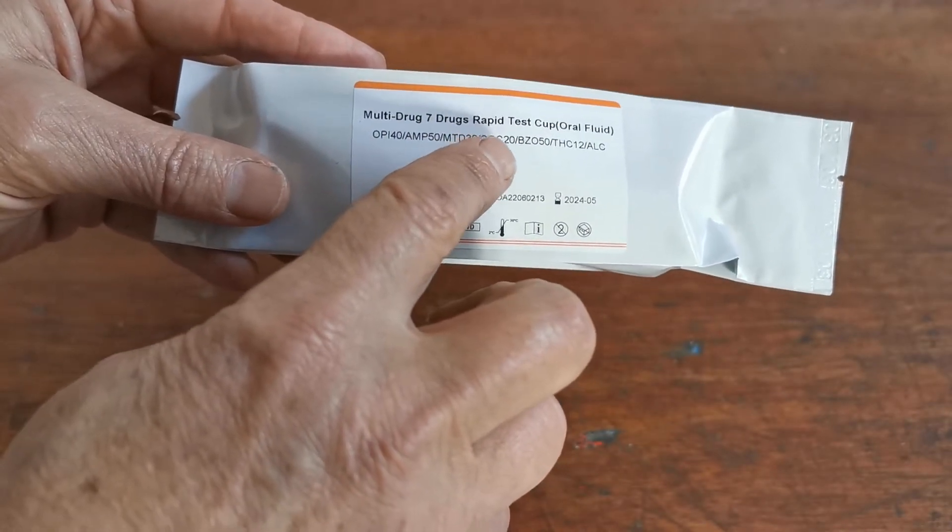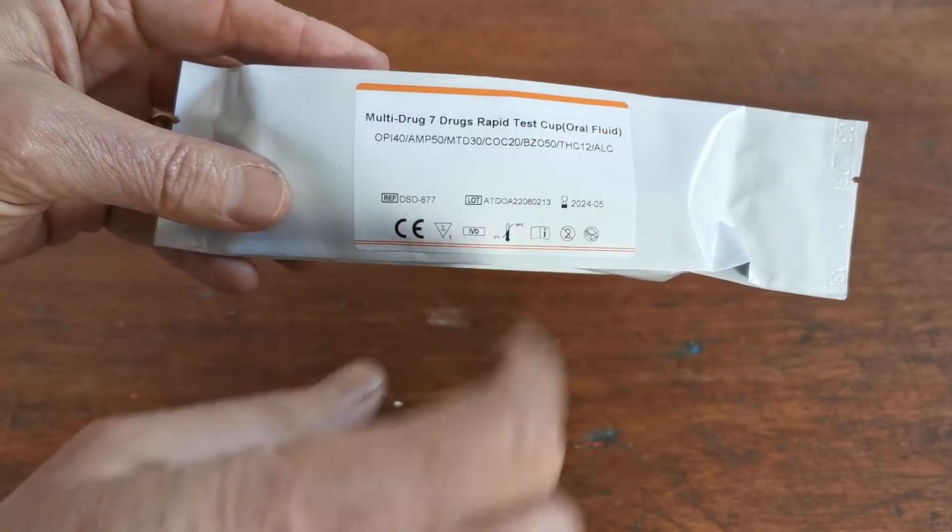This test screens for opiates, amphetamine, methadone, cocaine, benzodiazepines, cannabis, and saliva alcohol.